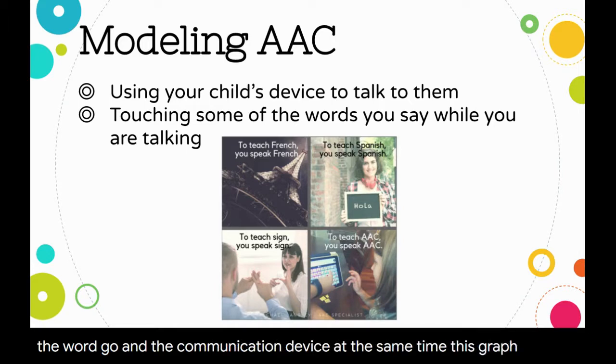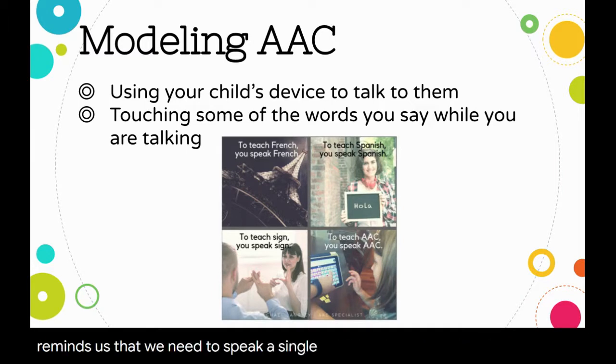This graphic here reminds us that we need to speak AAC to teach AAC. We have to provide children who use AAC language input using their AAC system. This will help them learn that they need to use the system to communicate, just like if we wanted them to learn Spanish, French, or sign language.